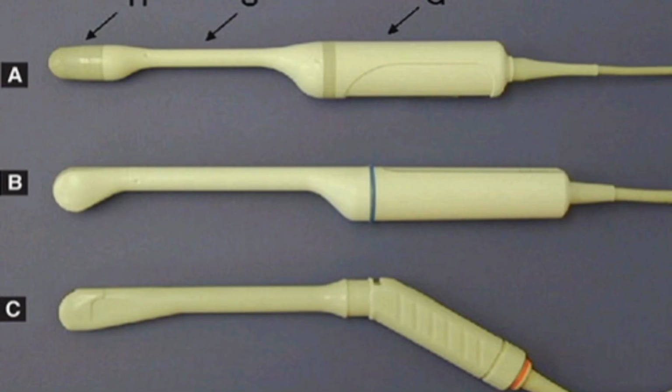A transvaginal sonography probe may be end fire or angle fire, with a straight or curved handle. I will show you some of the examples.